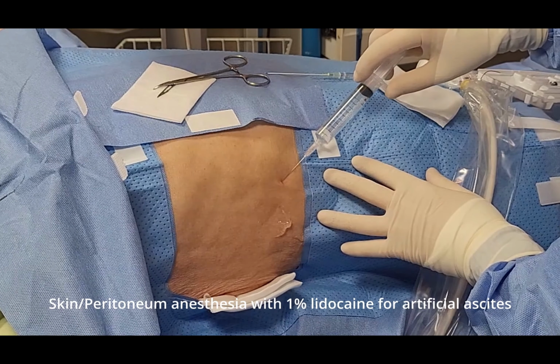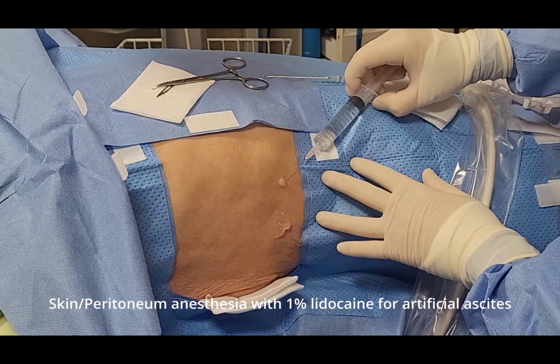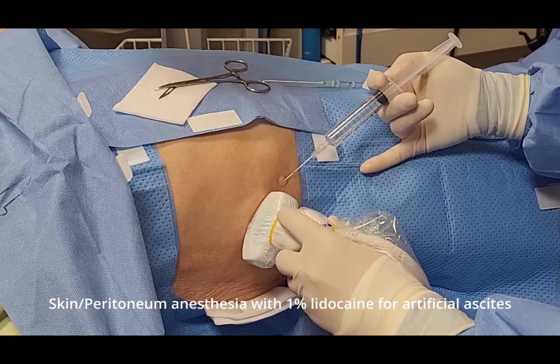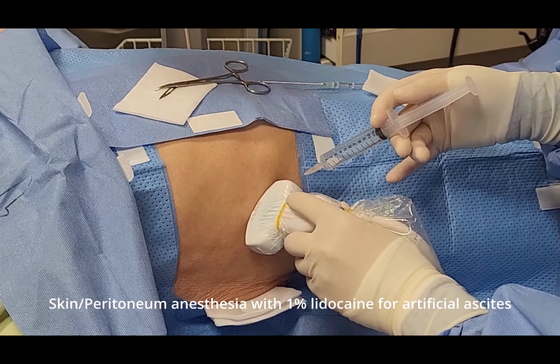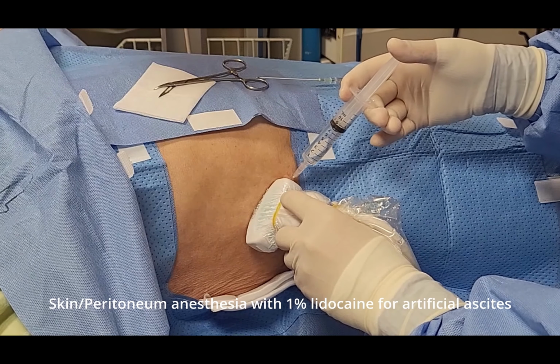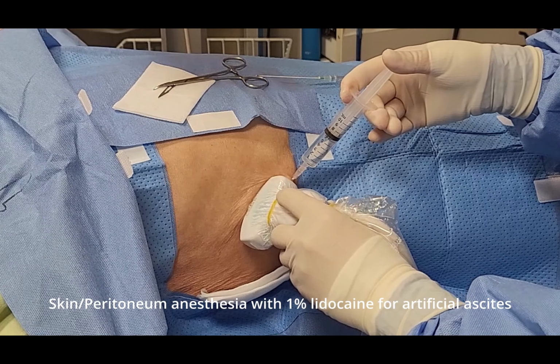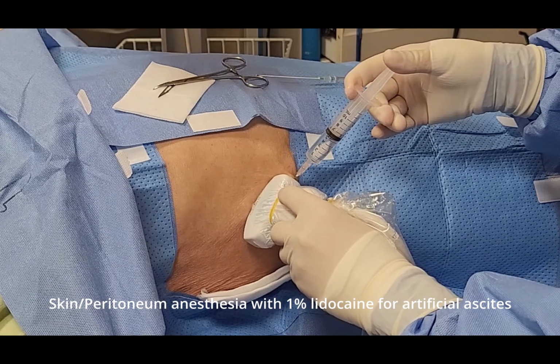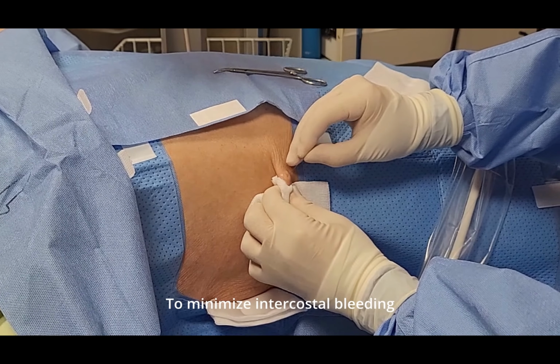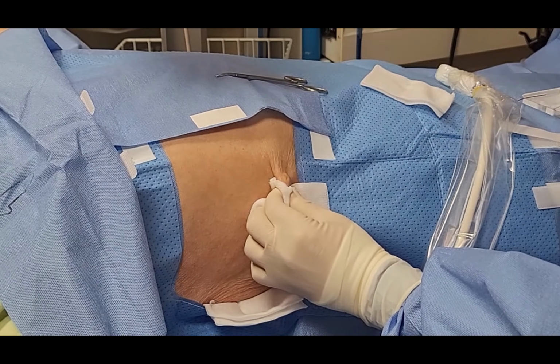So for skin anesthesia, to minimize intercostal bleeding, the skin stick.